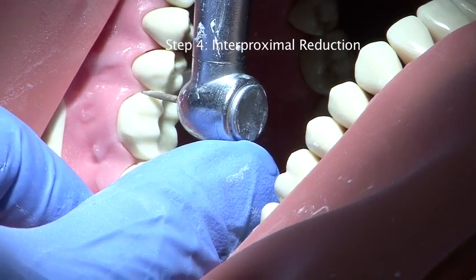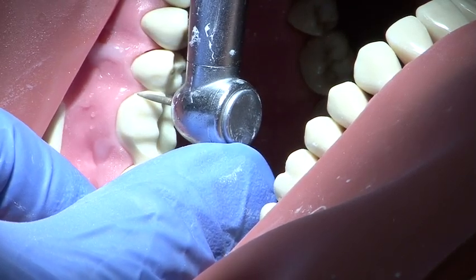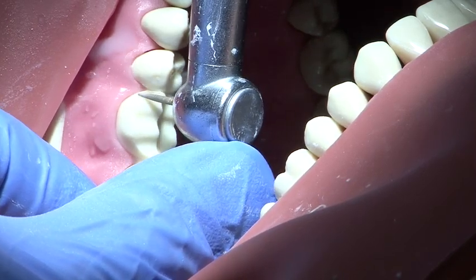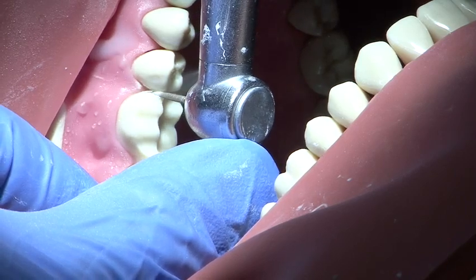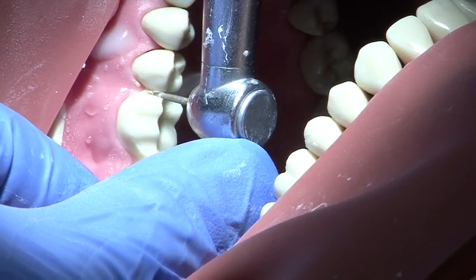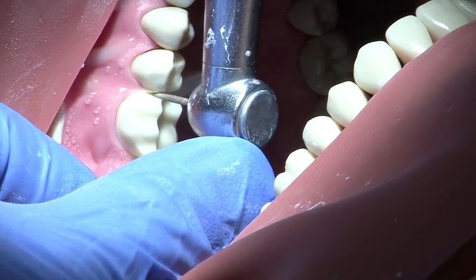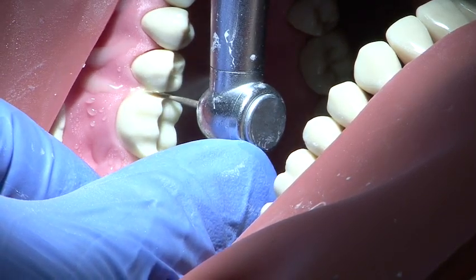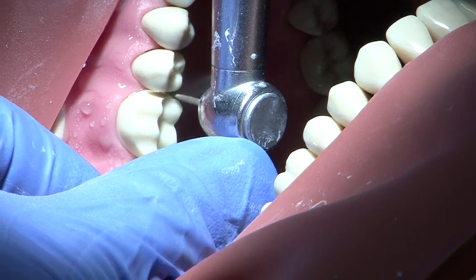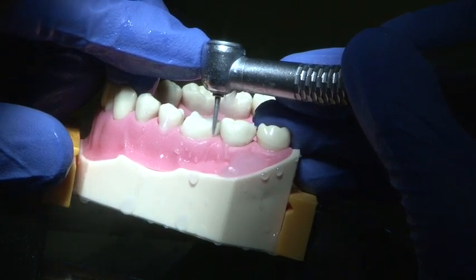Interproximal reduction is carried out using a fine point medium grit burr. The handpiece is supported with the free hand at all times and a smooth continuous action is used to avoid damaging the adjacent tooth. This is then repeated for the distal surface.